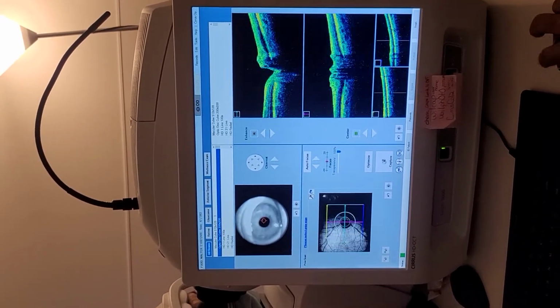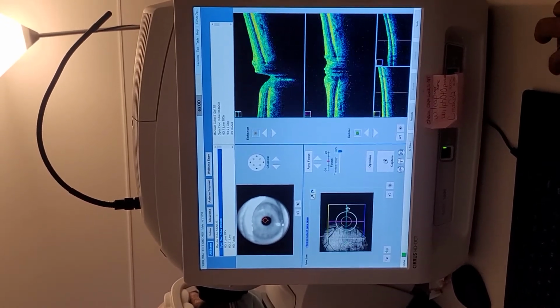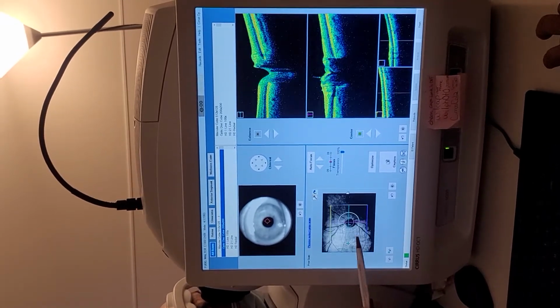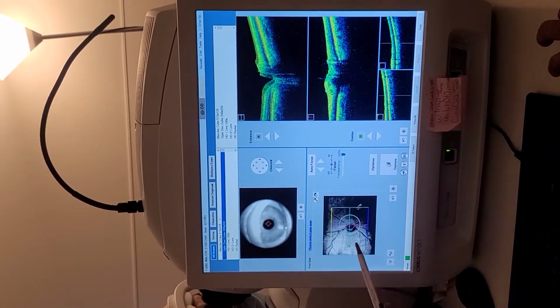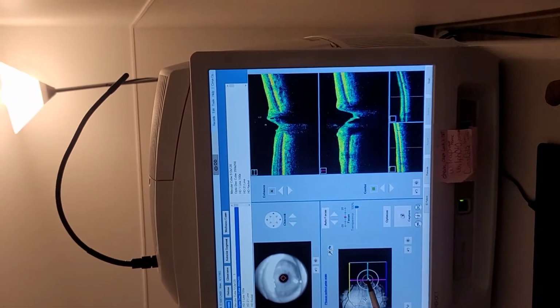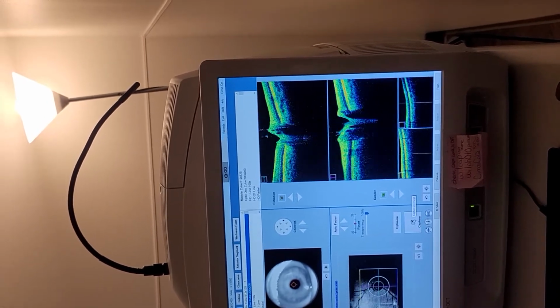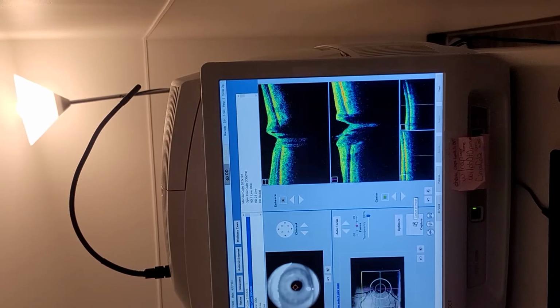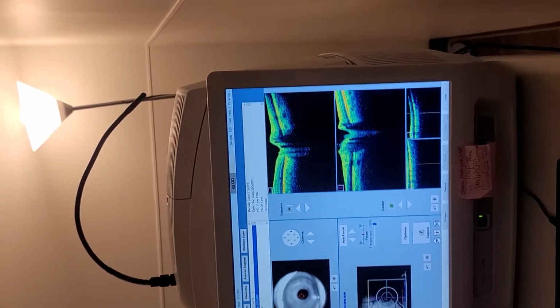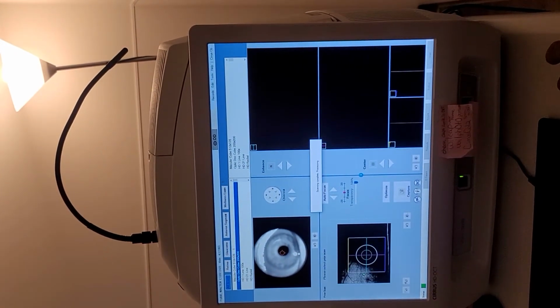Okay, now, is he looking at the green star? Look towards your left at the green star. Move this over, because you're gonna watch this. Move it right in the center of that. Okay, see, good, great. Now look at the green star. You're looking at the green star? Yes. Okay, now what are you gonna say? Don't blink, don't move. Look to the green star, okay? Now I'm gonna tell you something when it's done.